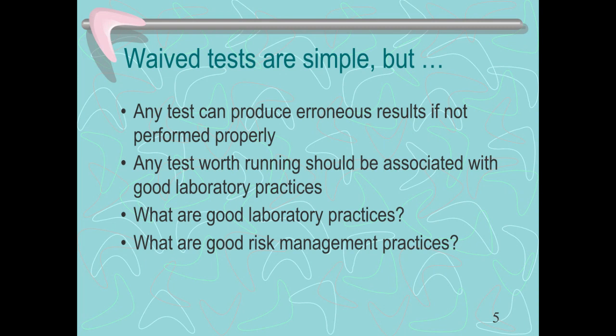An example, right now they are doing lots and lots of rapid flu screening. So it tests for flu A and B, and many of you may have had this done, but they have a specific swab that they have to stick way back in your nose and wiggle around, and then there are some specific procedures that we'll talk about that must be done after that.